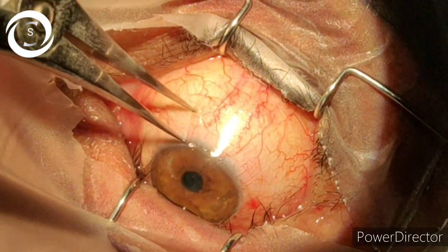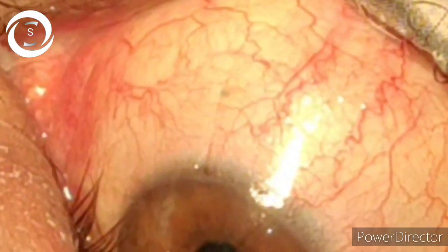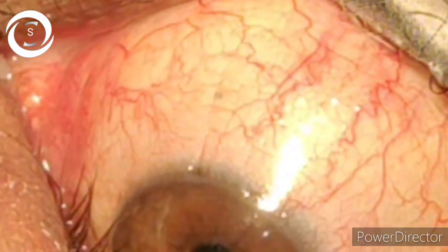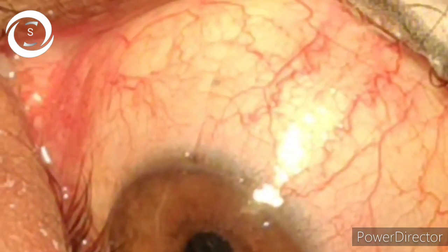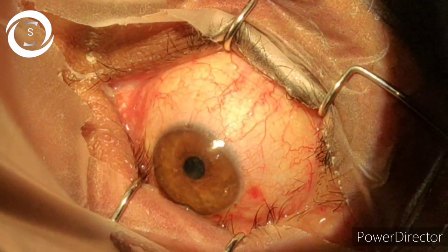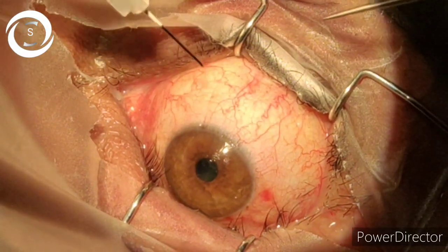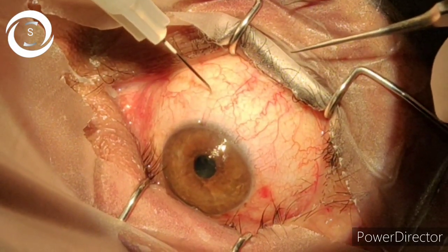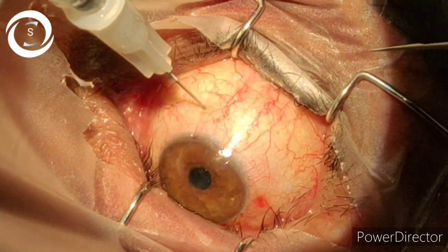Now once again at the end I would like to tell you the steps of the procedure. Step 1 is that the patient should be lying comfortably in supine position. Step 2 is to confirm the actual patient by asking his name, his patient ID, and confirm which eye is to be injected and tally it to the notes.